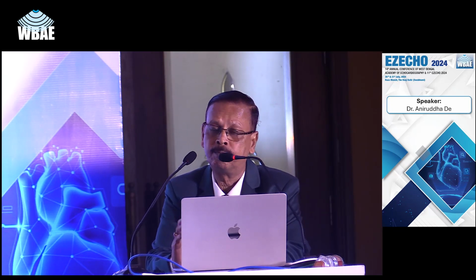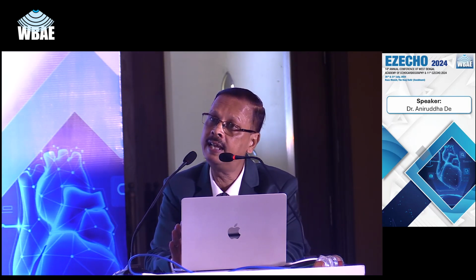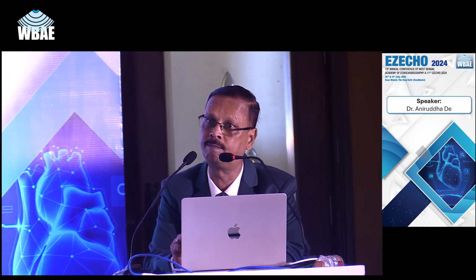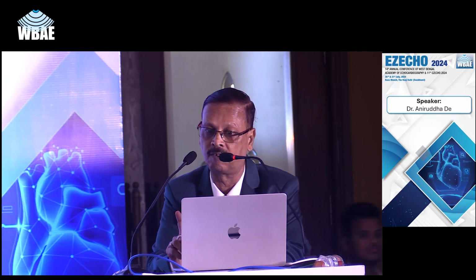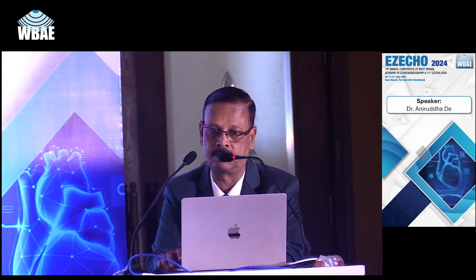So the first choice is to measure the mitral inflow E deceleration time, DT, by pulsed Doppler. It is easy, and a highly accurate measurement. However, this is only for subjects with reduced left ventricular ejection fraction. E DT is not a good determinant of filling pressure in patients with preserved LV ejection fraction.